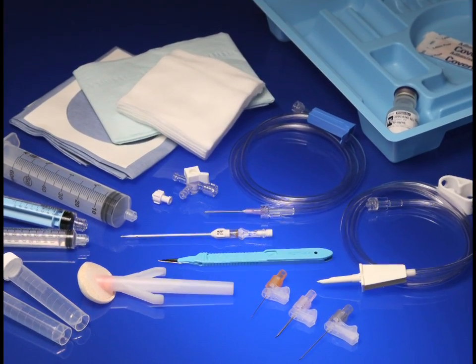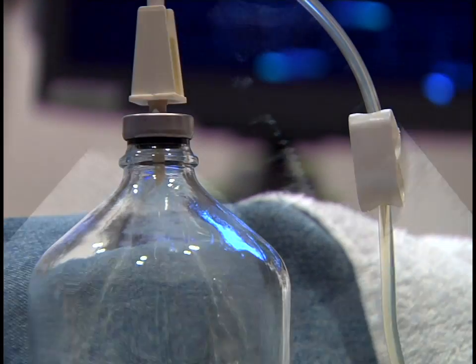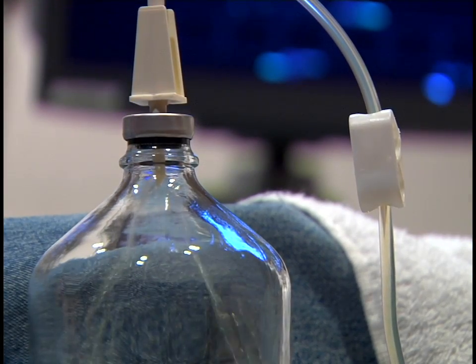Merit Medical's Thoracentesis and Paracentesis Set, or TAPS, is intended for drainage of fluid and specimen collection for diagnostic purposes or to remove excess fluid collections.